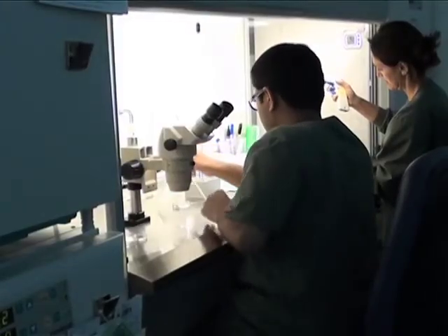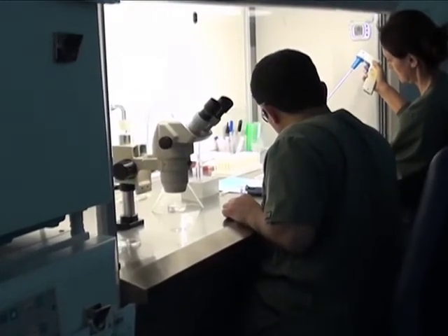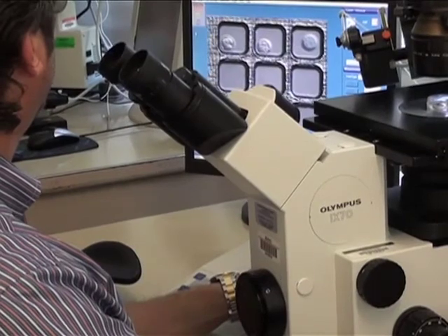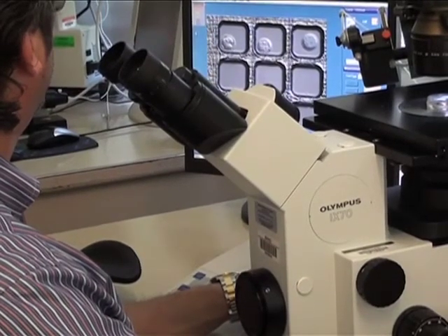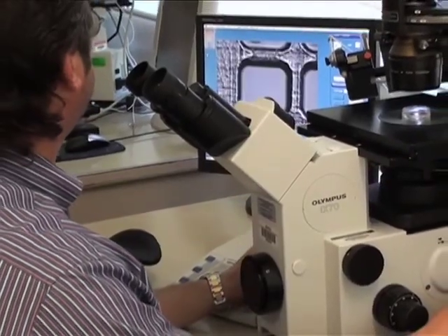Automated extraction of the cell cycle parameters will be performed for each embryo using a cell tracking algorithm. Embryo selection for transfer will be based on the predictive imaging parameter analysis in addition to other criteria currently used in clinical practice.